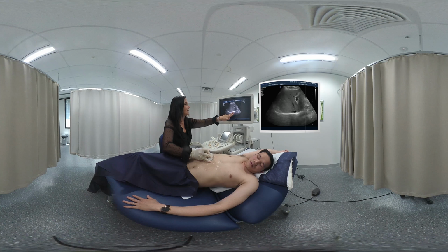Now we're just going to turn in transverse and we're seeing our left side of our liver here. So breathe away patient, we're going to fix our focal zone, big breath in. So we're doing the lateral aspect of our liver, so we can see our lateral tip, which we'd like to keep on. Coming down to our stomach, we can see our stomach there, full of fluid. Lateral tip of the left liver. Now this is our left portal vein, as we can see it there, coming through, going all the way through, and coming down once again through our left side of our liver.